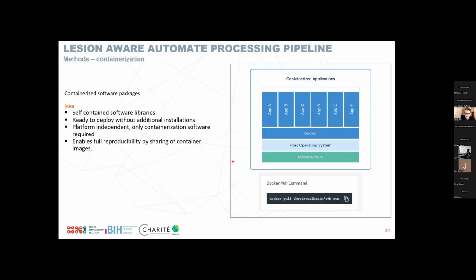And for the reproducibility part, as I mentioned, we created a Docker container, but the basic idea of Docker containers that is contained in the name itself is that it is a self-reliant container where everything that you require to perform within this application is contained in this Docker container. So that if you want to be able to run it, all you need to do is to be able to run any container, as you've seen here, and then all the software that is actually required to do whatever is happening inside the application is already contained in this.